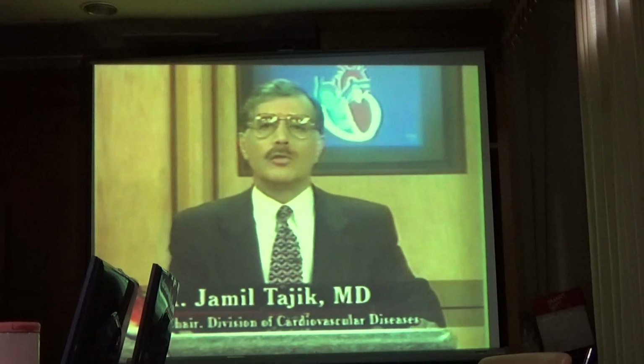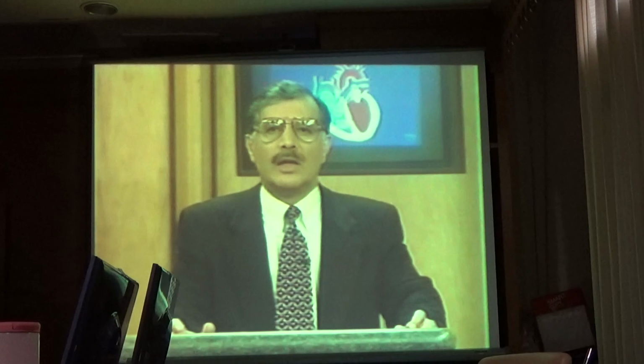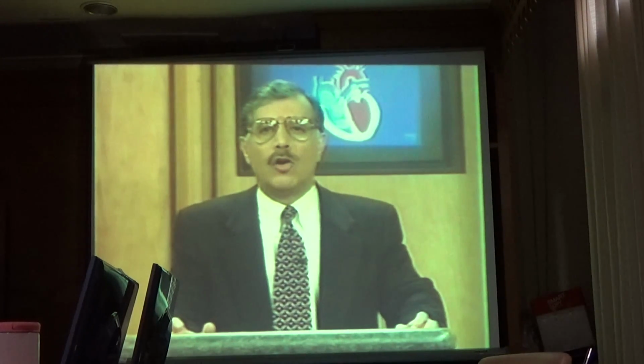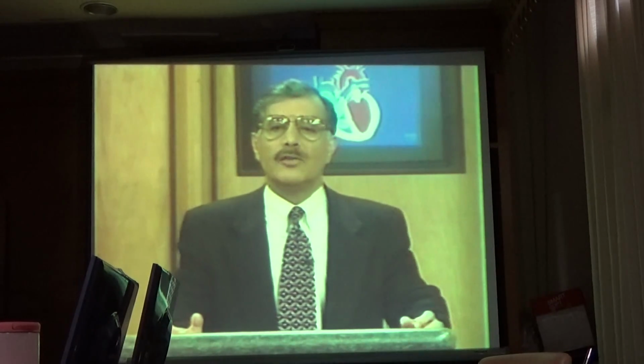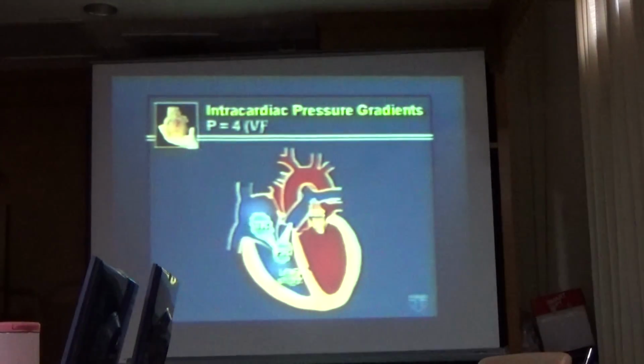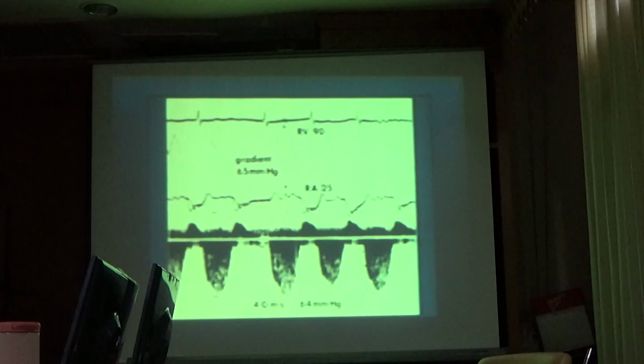Now let's move on to the next subject, which is determination of intracardiac pressures. This is based upon recording the peak velocity of the regurgitant jet. As shown in the slide, we have schematically demonstrated various regurgitant jets from different valves. In routine practice, we use tricuspid regurgitant jet velocity for measurement of right-sided pressures. Dr. Sharon Hayes will be elaborating on this further in her presentation.